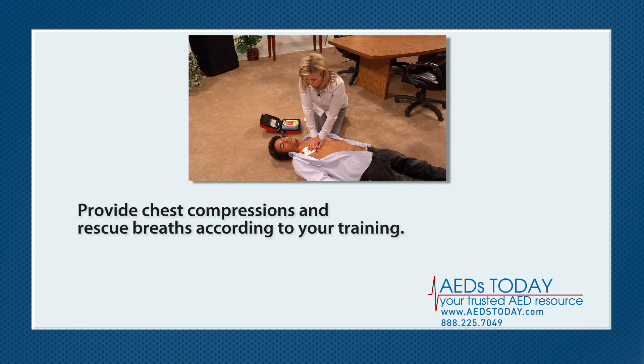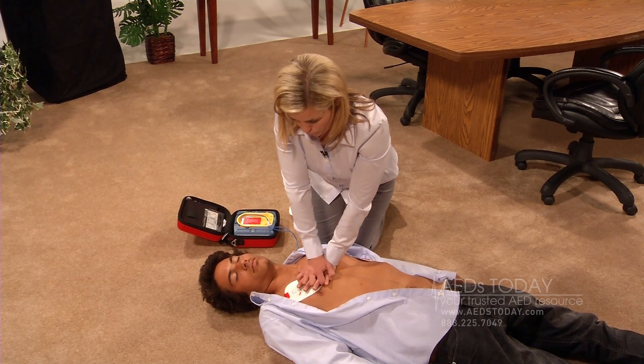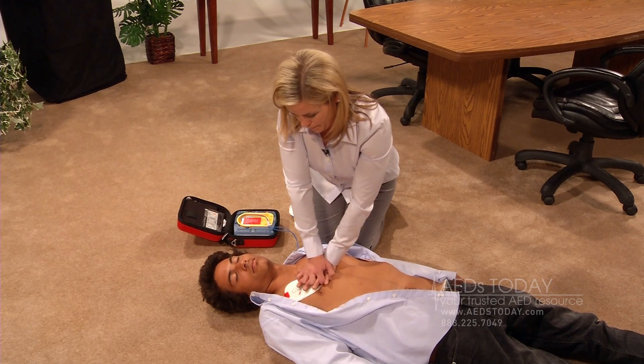Provide chest compressions and rescue breaths according to your training. Continue CPR until the AED tells you to stop, emergency medical personnel arrive, or the person starts moving. While you perform CPR, the AED will interrupt you at regular intervals so it can check if another shock is necessary.